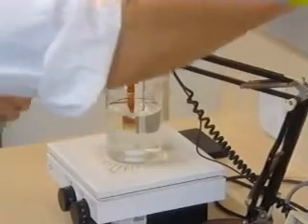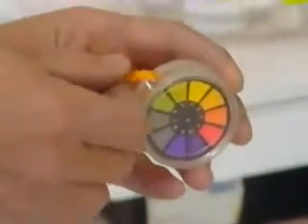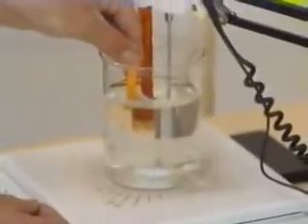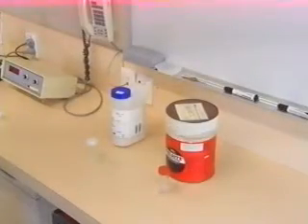A pH meter is necessary in big laboratories, but if you are a hobbyist and have no access to a pH meter, pH paper with narrow range would be just fine. As a general rule, the pH of most tissue culture media is set at around 5.6 to 5.9. The gelling agent is then added.